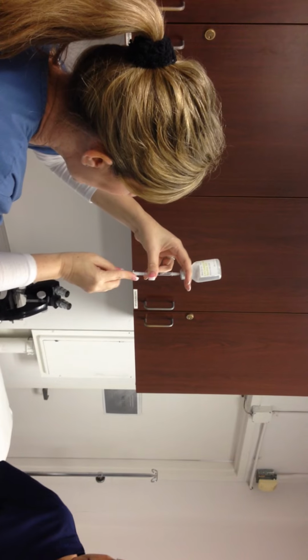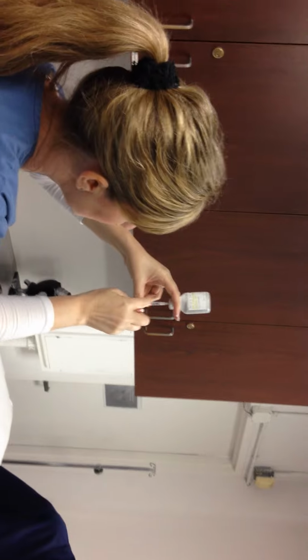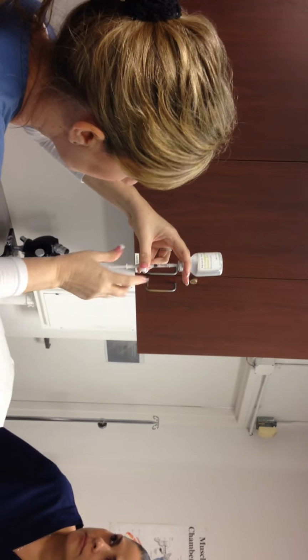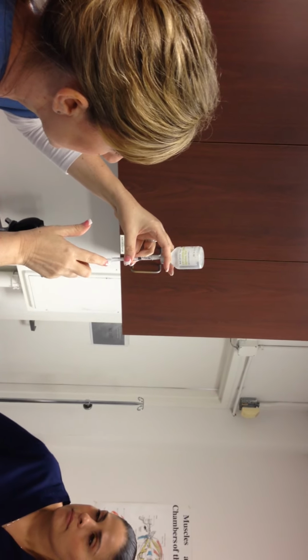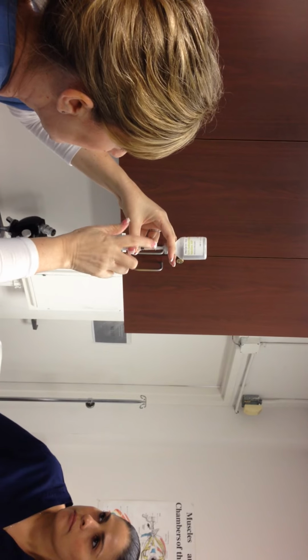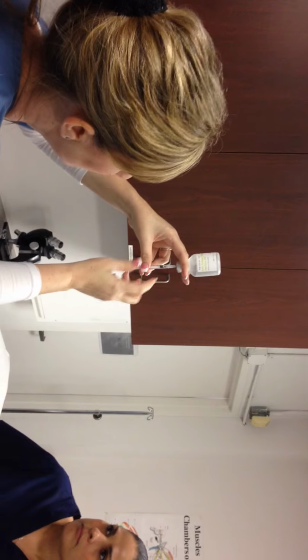Now I'm going to pull this way down really fast, past the amount that I need, because we need to fill in that space all the way up through here, okay? And I'm looking to see right here, and we don't want to push this sideways here because we're going to bend our needle, so keep it straight. And I'm looking here, 0.1, there we go.